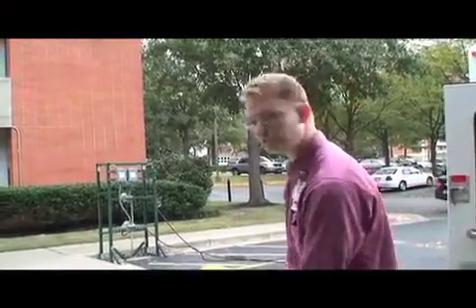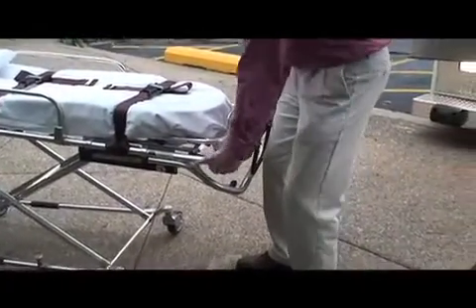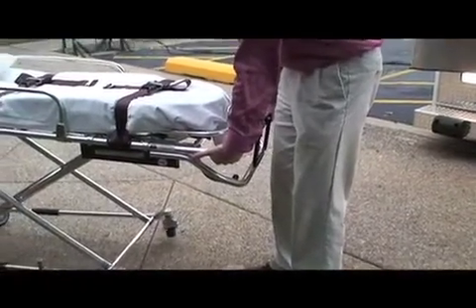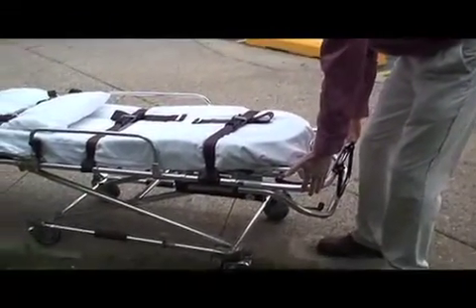To raise and lower the stretcher, it's a two-man stretcher, but it's one-man control. So whoever's at the foot, that would be me, has all of the controls for the stretcher. So what you're going to want to do is grab hold of the stretcher, both you and your partner. You're going to want to lift to get the weight off of the stretcher, squeeze the handle, and then you can go down. When you get to where you want to stop, you release the handle.